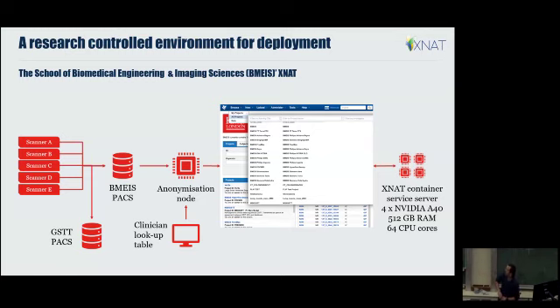Picture Archive something System. PACS is basically an archiving tool within which you can store imaging data, and it's actually relying on a protocol which is called DICOM, which is, let's say, a file format in which we store medical images. Okay. What's the C? Computer.